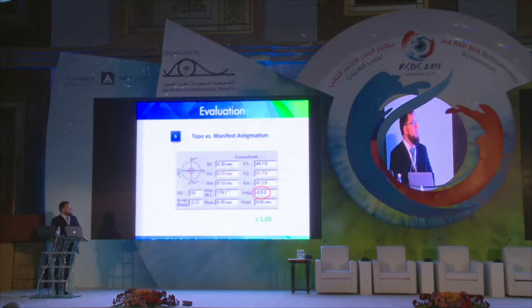In Galilei, there is total astigmatism. It can give us the total astigmatism. So, when there is a difference of more than 1 diopter between the amount of topographic astigmatism and that of the manifest astigmatism, it should be suspicious. And when there is a difference of more than 15 degrees between axes, it should be suspicious.